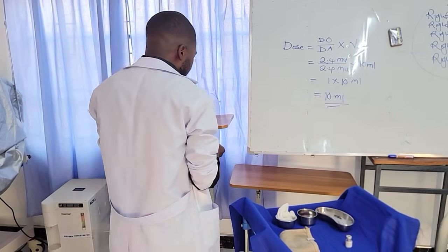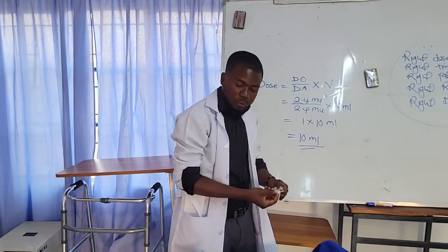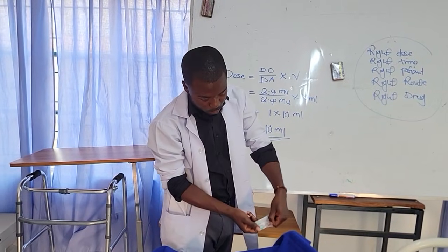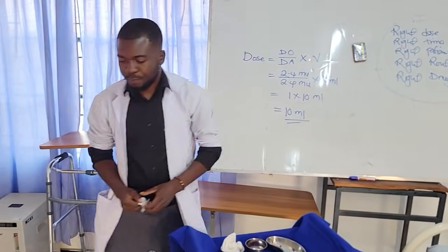So we are saying you introduce 2 needles. The other needle will be used for withdrawing the drug. The other one will be used for injecting there. So meaning you have to change. So you do that.